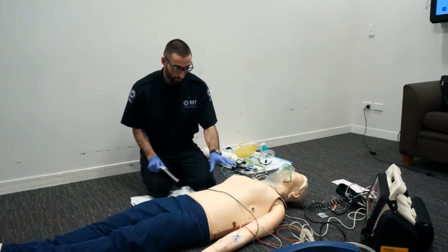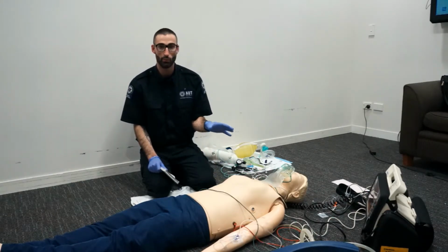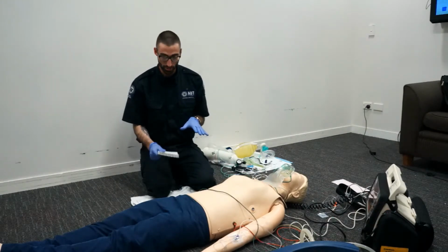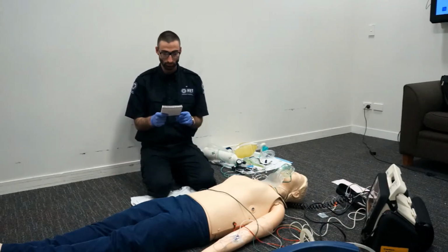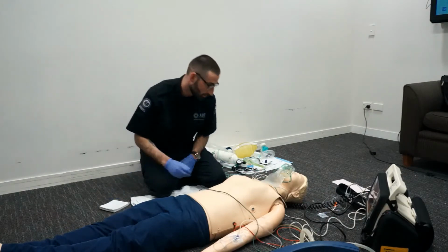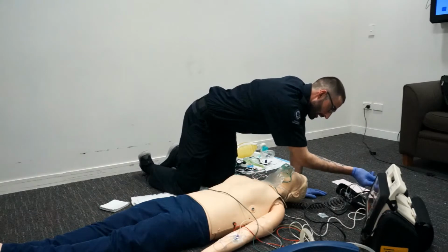We have our NIBP with our cuff on the arm here, monitoring the blood pressure. We want to maintain a systolic blood pressure of 120 millimeters of mercury as this patient's in severe TBI, and we want to maintain cerebral perfusion pressure. We have our SpO2 probe attached to the finger, and we're monitoring that as well. Prepare capnography if this is available. We do have this available. We'll attach that to the ETCO2 and let that calibrate.